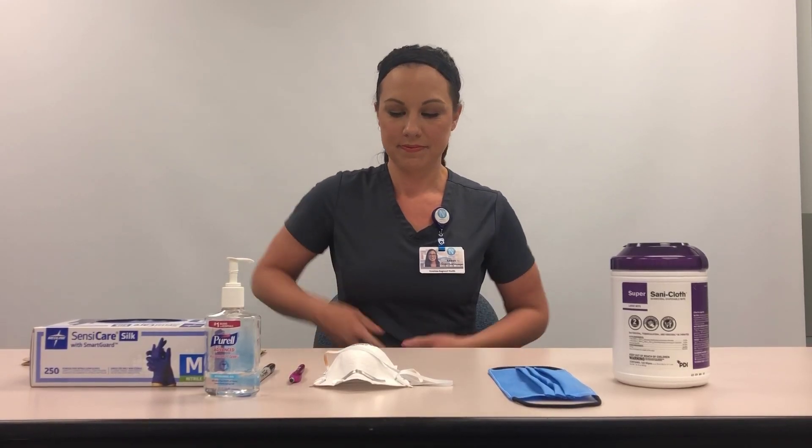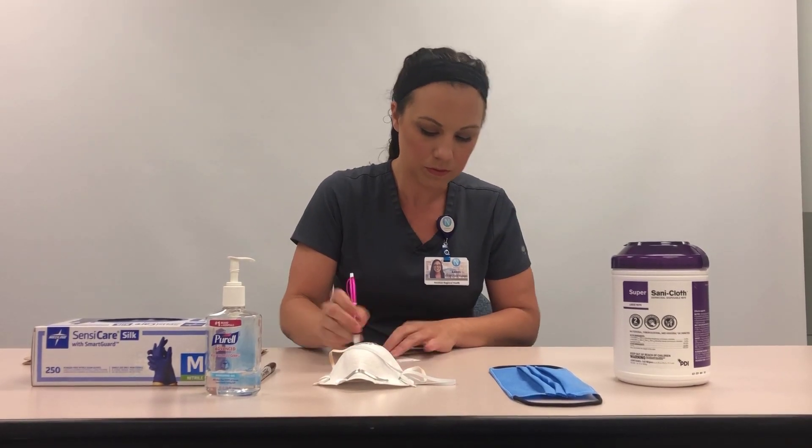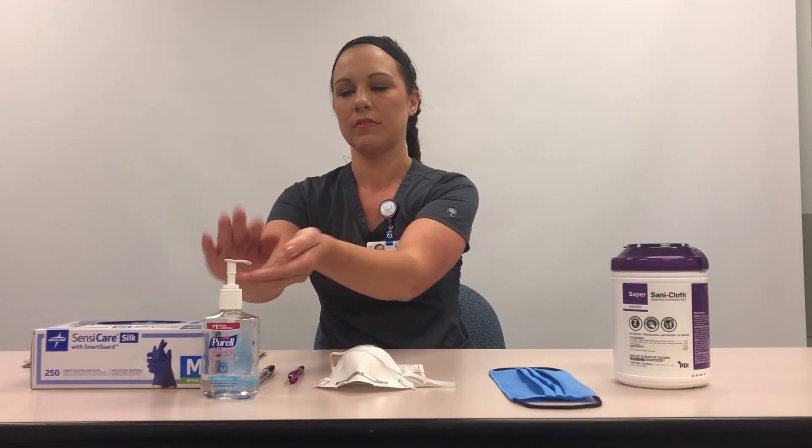Note the time on the Airborne N95 respirator bag tag. Perform hand hygiene and don clean gloves.